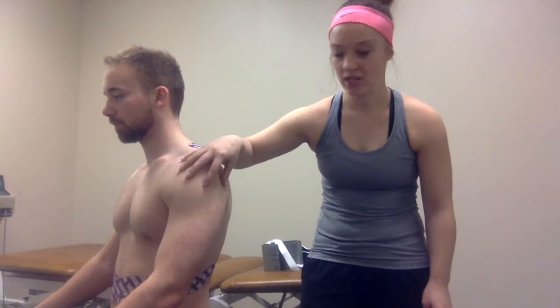I'm going to be demonstrating a taping technique for AC joint sprain or separation. We're going to be using Leukotape. My first strip is going to be this white underlying tape — it's HypoFix, the brand.